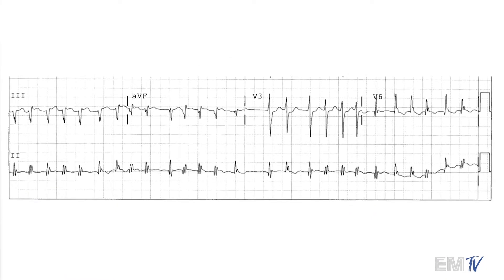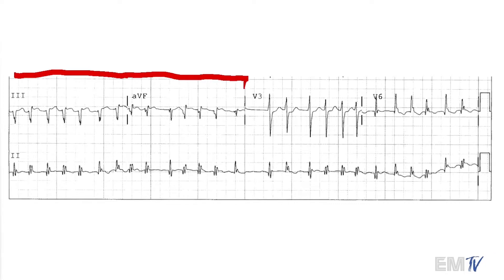Right off the bat, the first thing you're probably realizing is how fast the rate is in this particular 12-lead. Now remember, we're looking at a 10-second strip here. So unless your base-six math is really good, the first thing you want to do is cut this into a six-second strip. So what we'll do is take the first two groupings here — each one equals 2.5 seconds, giving us five seconds total — then we'll add five large boxes and have our six-second strip.